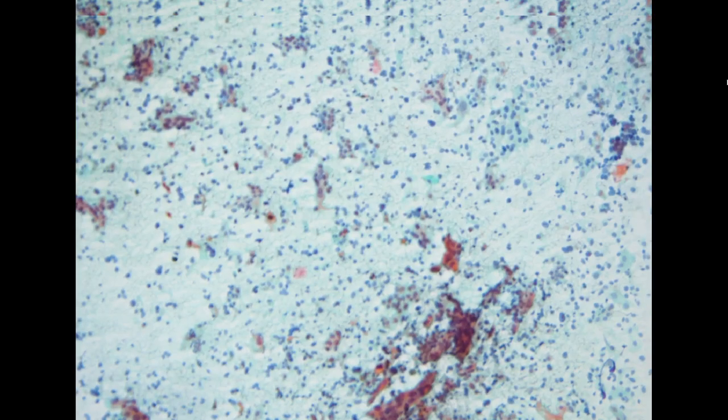It's weird, she's only 45. Unusual, unfortunate for this patient. So basically, the patient has been iatrogenically postmenopausal for a long time. So here, this is an atrophic smear, right? We see more cohesive clusters instead of individual cells. In the background, there are a lot of cells with naked nucleus.